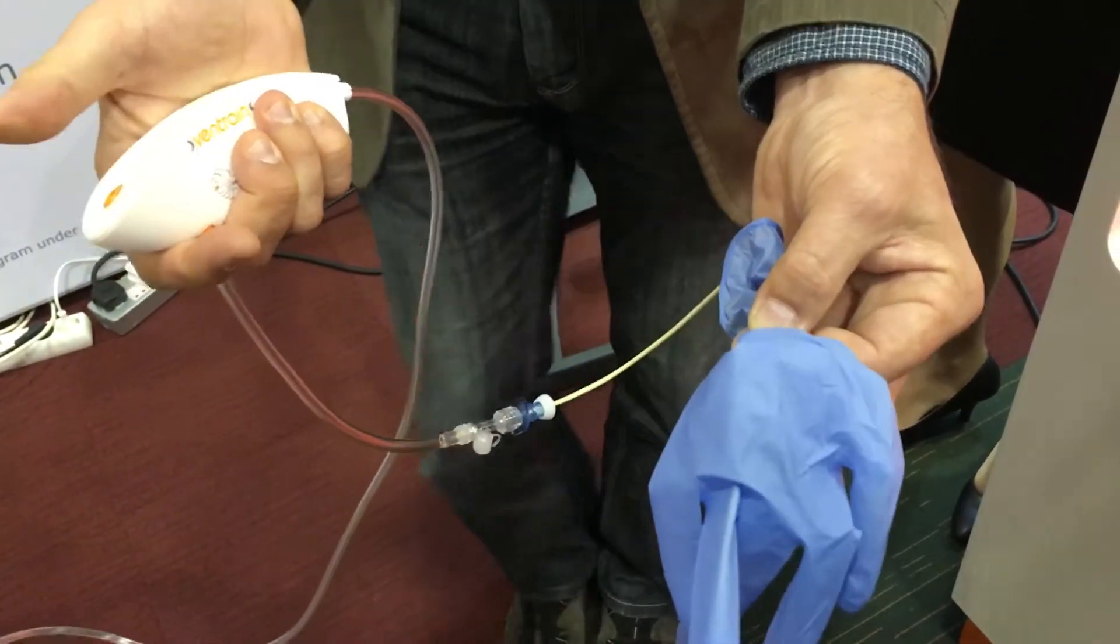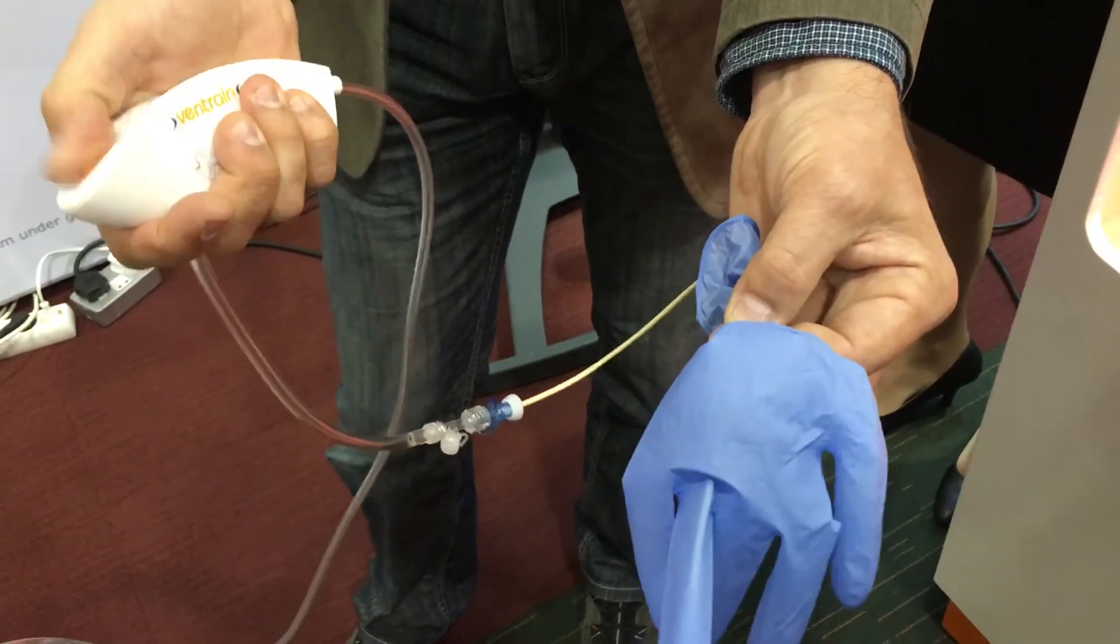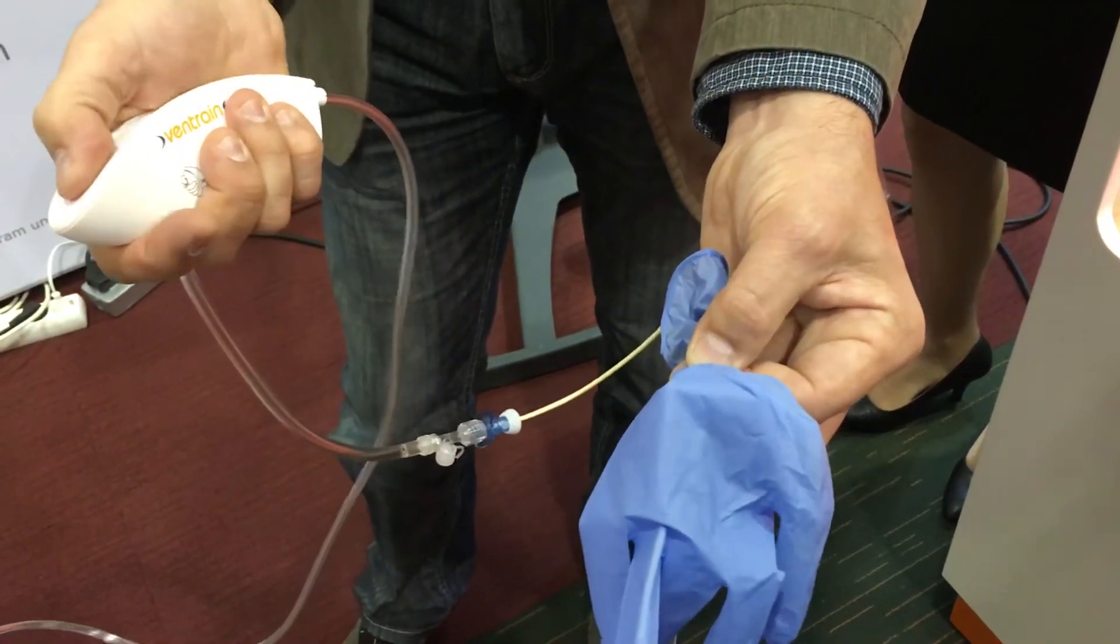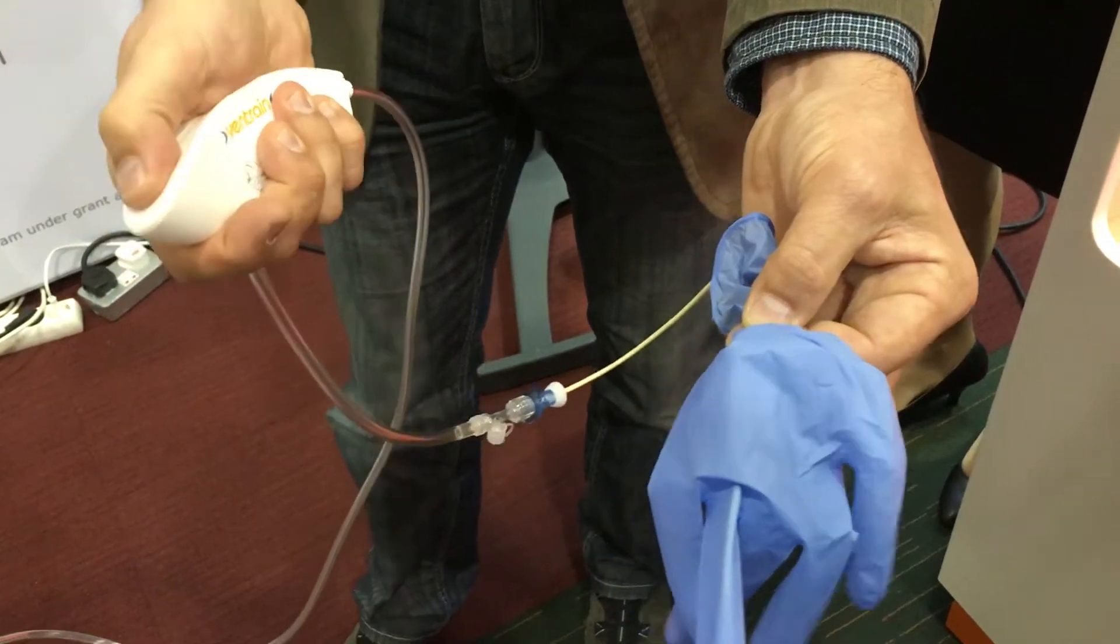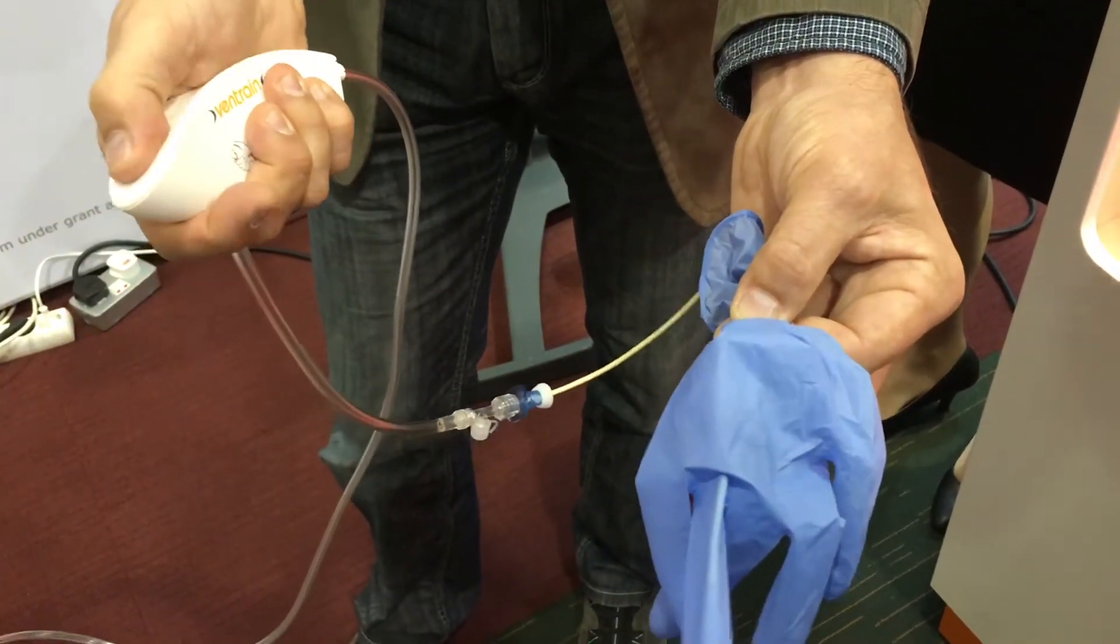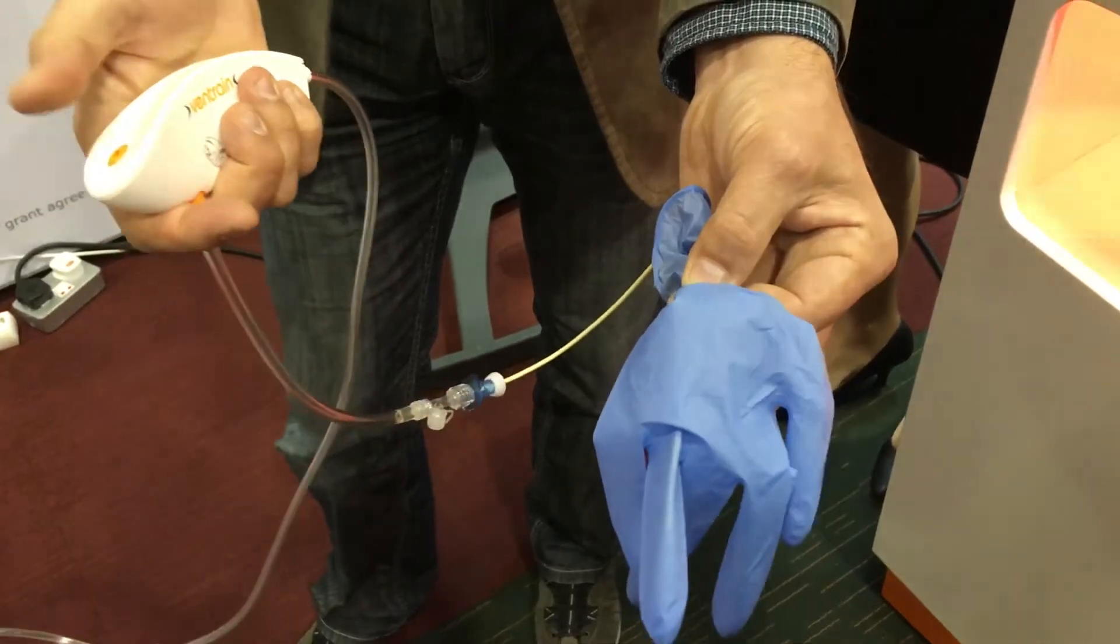For example, I've now set the flow to 6 liters. That means, if I redirect the flow for one second to the patient, it means insufflation of 100 cc, okay?